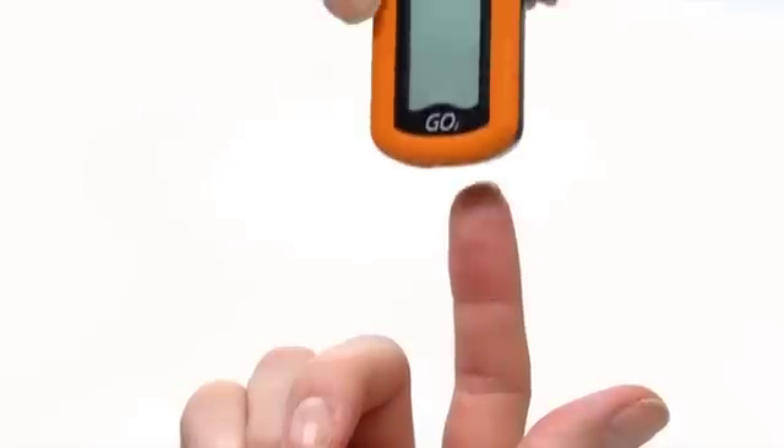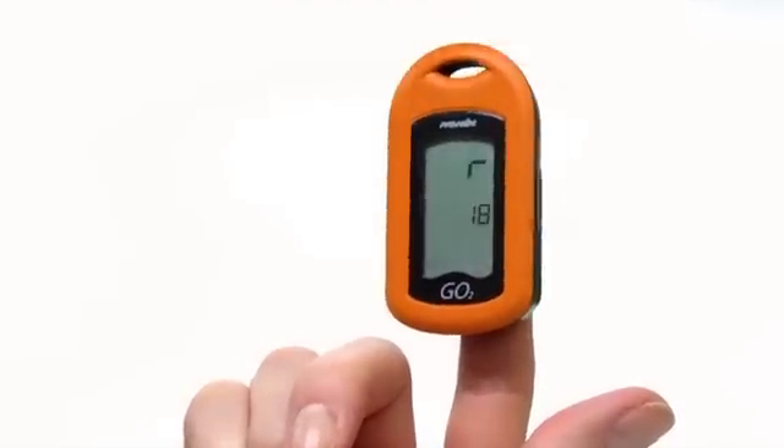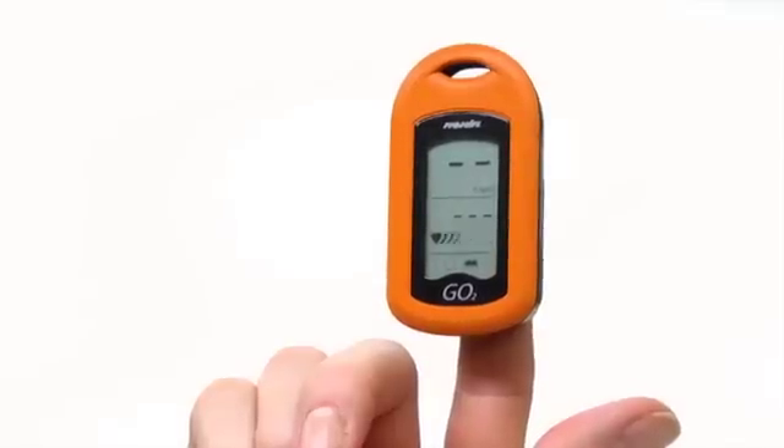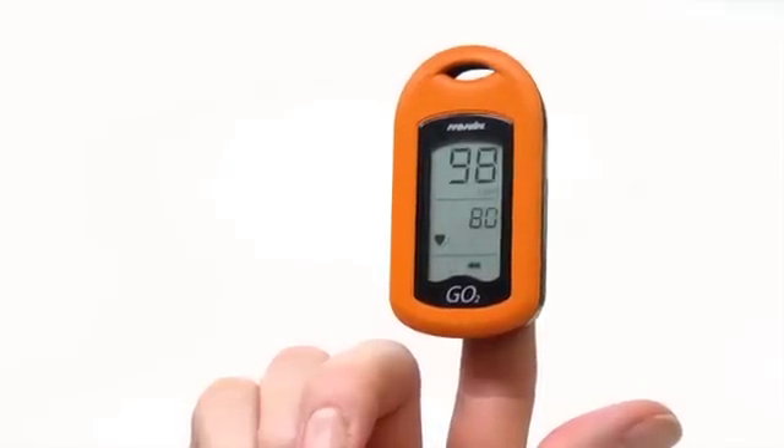The GO II Oximeter will automatically turn on, run through a brief self-test, and begin displaying your SpO2 percentage and pulse rate. No calibration is needed.